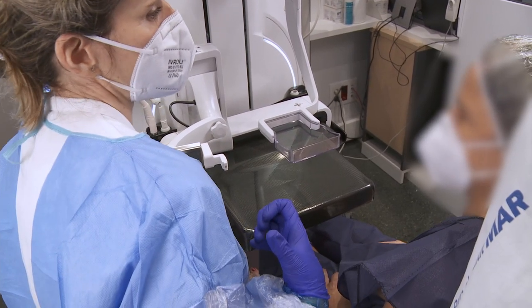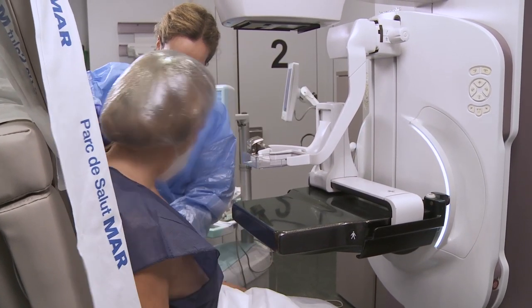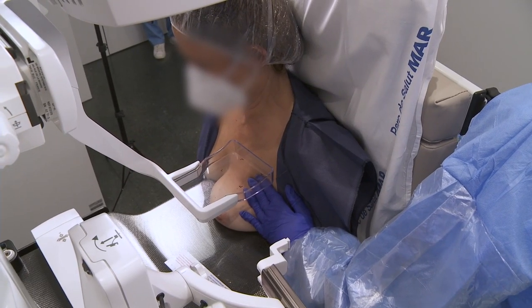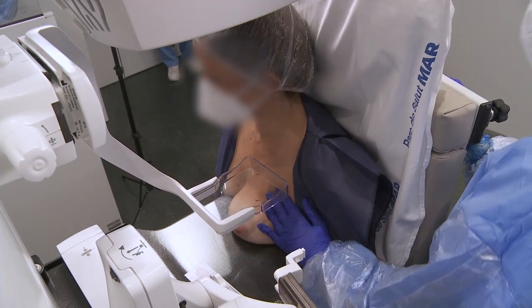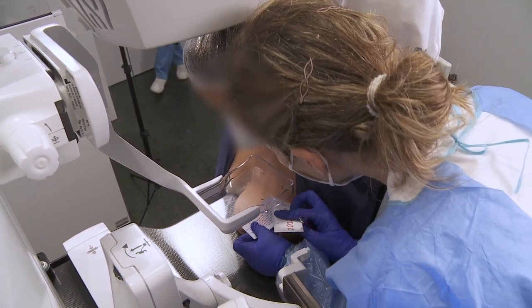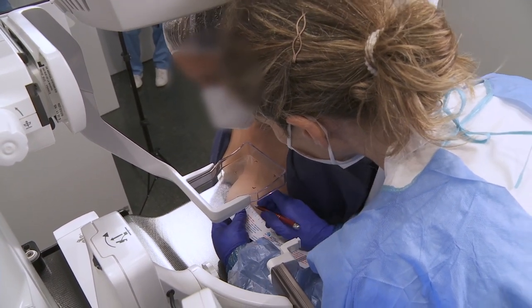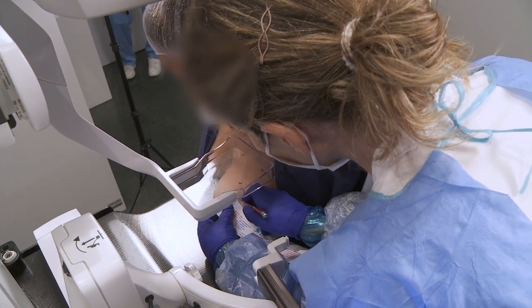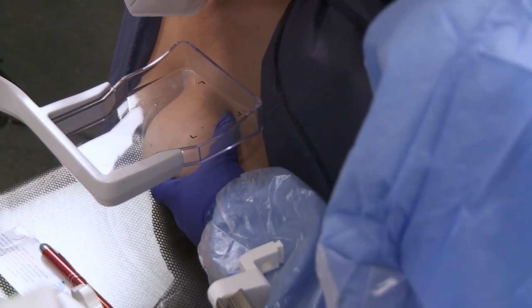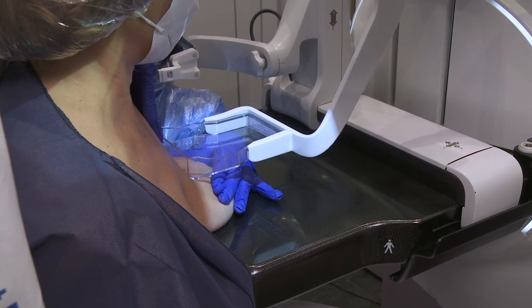When positioning the patient, pay special attention to her comfort. The patient is positioned for a cranio-caudal projection, horizontal approach, with external access procedure. The measurements taken previously on the cranio-caudal projection image are replicated on the breast to facilitate positioning. Adequate breast compression is applied.